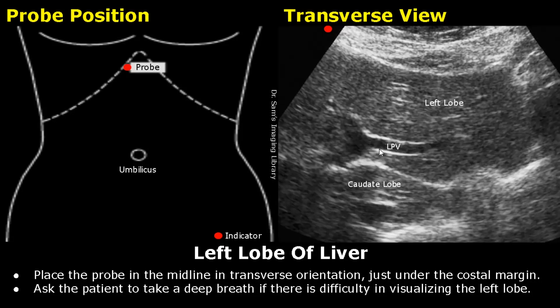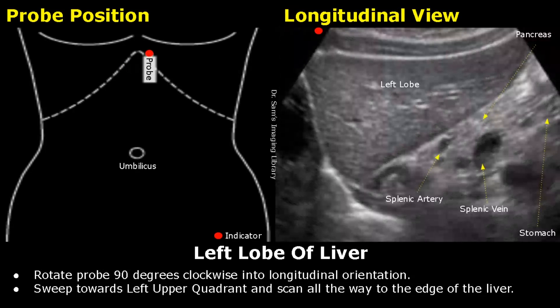This bright line is the ligamentum venosum and posterior to that is the caudate lobe. If there is difficulty in visualizing the left lobe, ask the patient to take a deep breath.